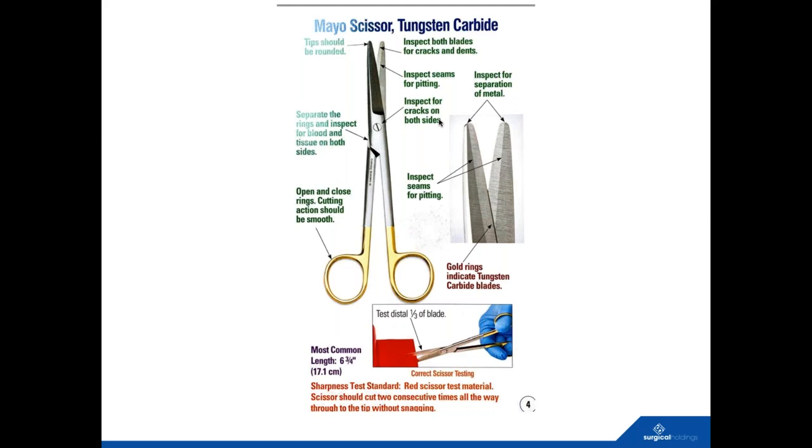And that's never a good place for the surgeon to be working in a very, very delicate part of the body and then find out that the scissors are not cutting and they're just kind of chewing the tissue. Then you've got a hurt patient, but also you've got a very frustrated surgeon who now is focused on his instruments not working or her instruments not working, where they should be focused on the patient. So it's really important that sterile processing CSSDs take over this quality management of the instrument sets. We want to send instruments to the operating theater that are fully functional every single time.